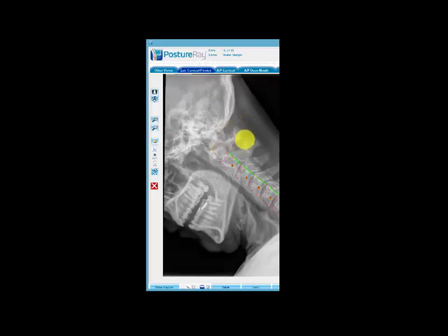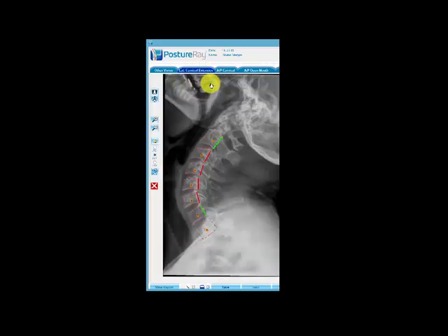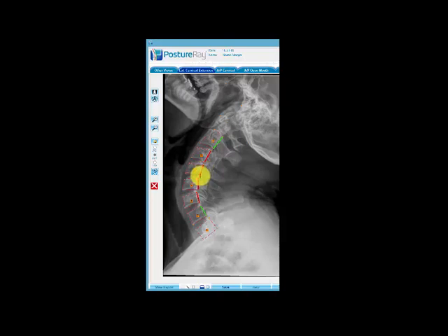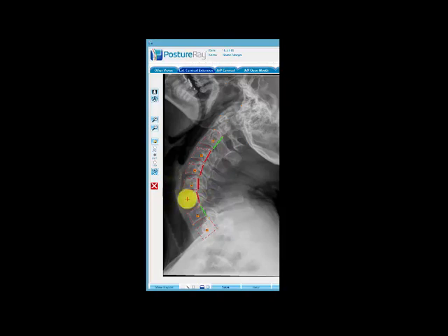When we bend the head forward we're not getting any opening, so I've got an upper neck restriction which I'll have my wife adjust next time she's in the office. When I bend my head backwards, something shows up — I had a sneaky suspicion I've got a disc problem at C5. Bending back, C4 moves back on C5, but C5 is moving back quite a bit on C6. Two years ago I was poleaxed into the jujitsu mats doing Brazilian jiu-jitsu and felt my neck crack, and that night had pins and needles in both arms.